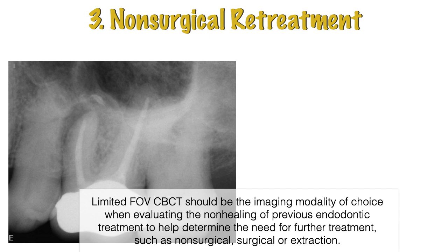For non-surgical retreatment, limited field of view CBCT should be the imaging modality of choice when evaluating the non-healing of previous endodontic treatment to help determine the need for further treatment, such as non-surgical, surgical, or extraction.